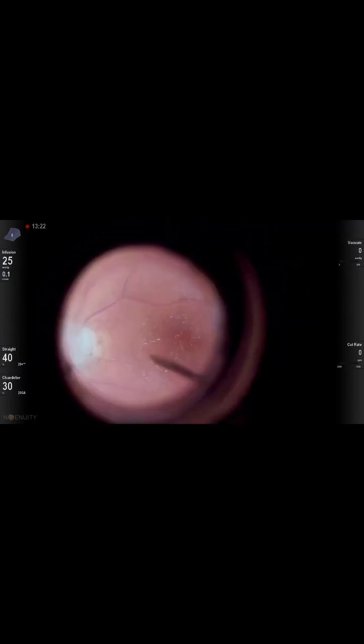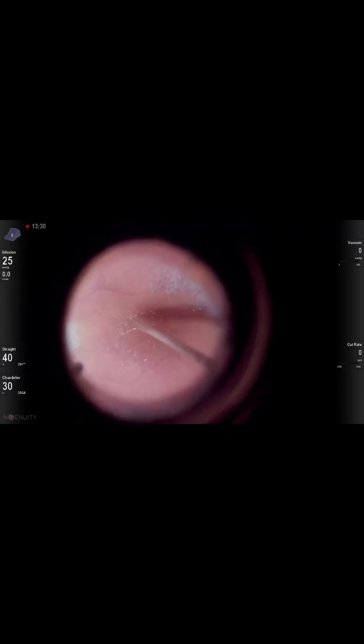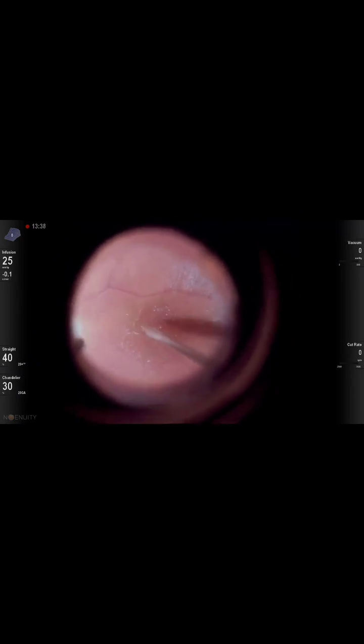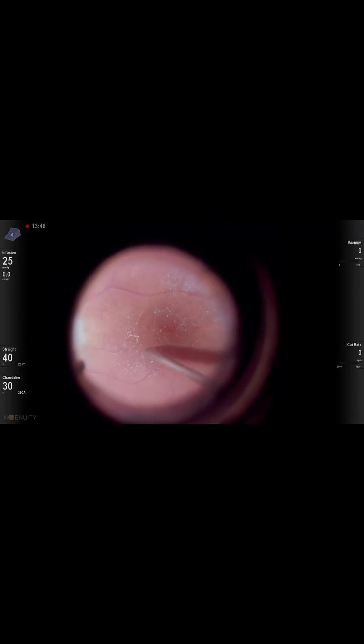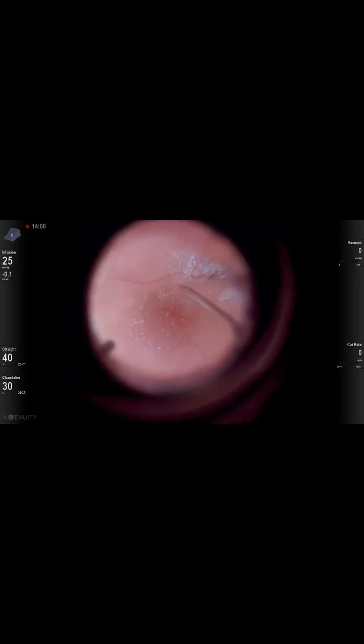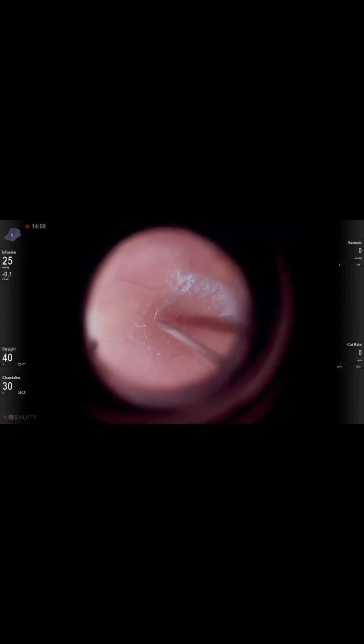Using a membrane pick instrument, the surgeon makes small openings in the posterior hyaloid around the foveal region. Note that he makes centripetal movements to perform these openings, aiming to isolate the perifoveal hyaloid from the peripheral posterior hyaloid, and takes great care to avoid generating traction on the fovea and consequently creating an iatrogenic macular hole with his maneuvers.